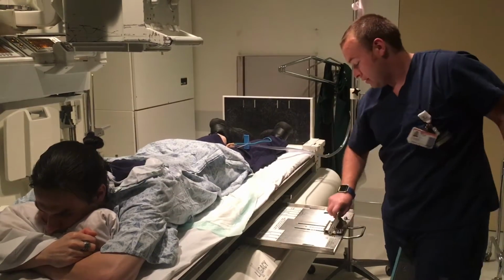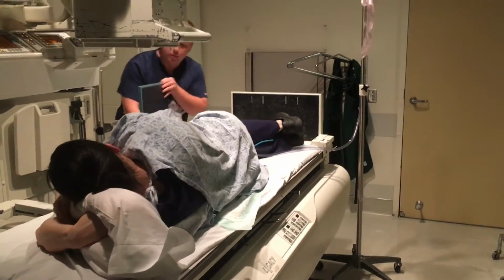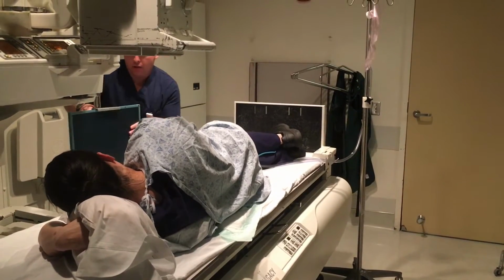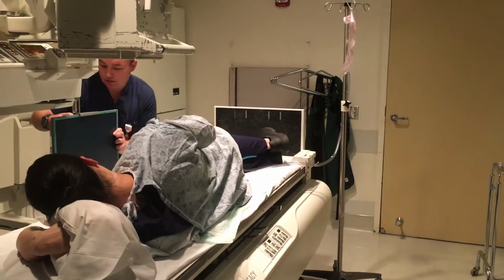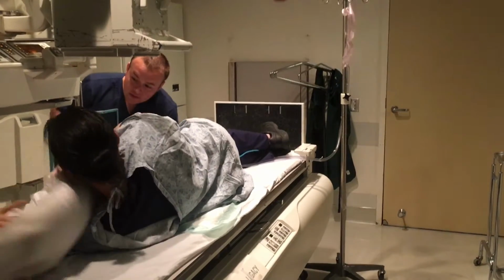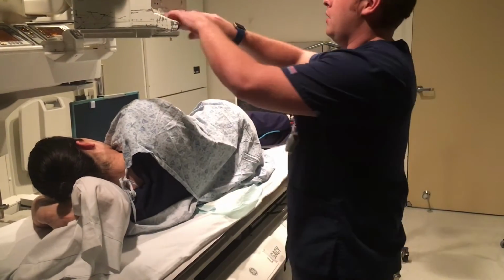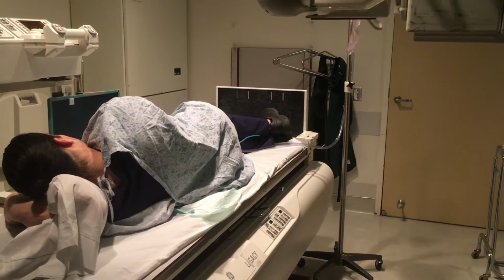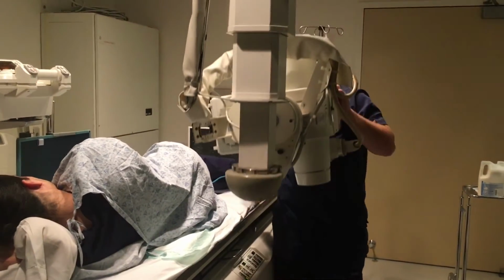Take this guy out. Go ahead and roll onto your left side, sir. This is basically like a KUB, but sideways in a way, essentially. We're going to center at mid-coronal and iliac crest. And you want to mark it with the side that is going up. So this is a left decub, but I'm putting a right marker because that's the right side up. SID still at 40.